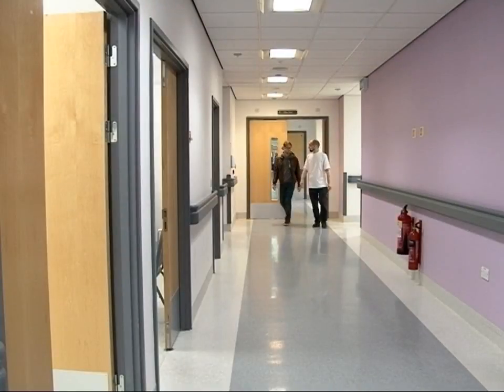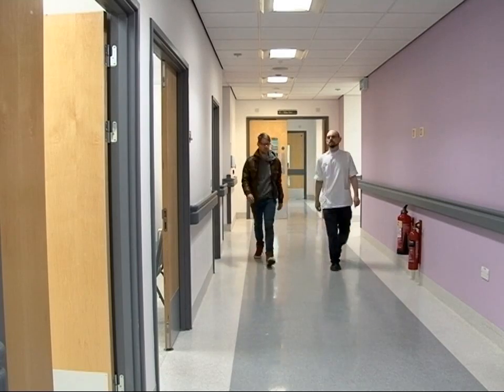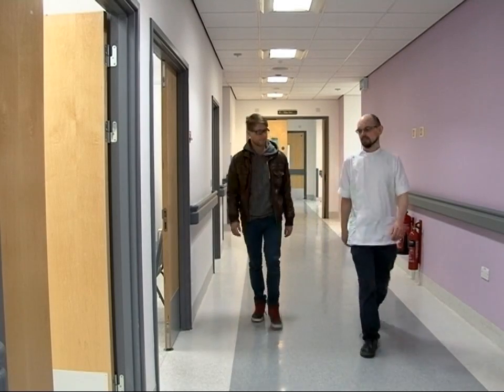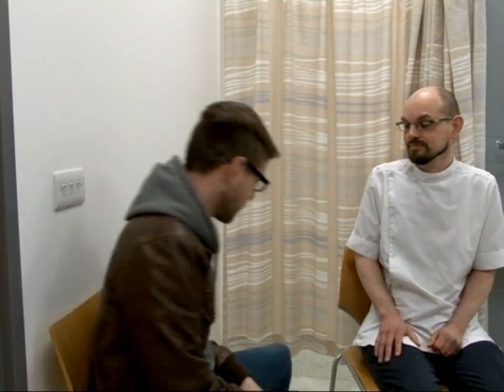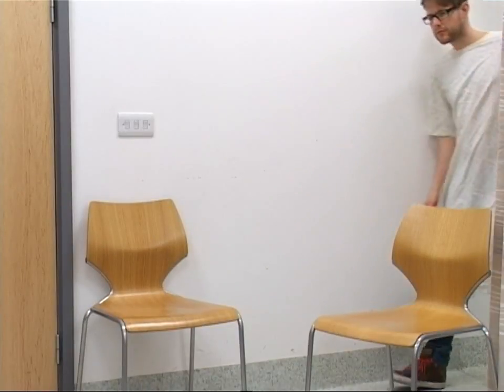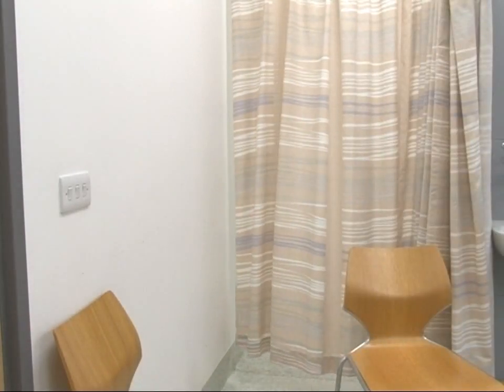The Mould Room team are highly trained technicians who specialise in making masks and other devices to help position you for radiotherapy treatment. Once we have explained the mask making process to you, you will be asked to remove your clothes and jewellery from the waist up. Women need to remove their bra. A loose strappy vest top is good to wear as you can just slip your arms out of the straps. You will be given a gown to wear and we will keep you covered as much as we can.